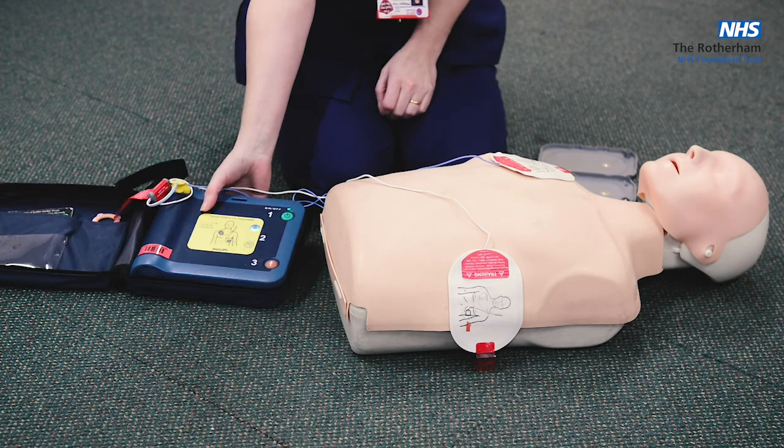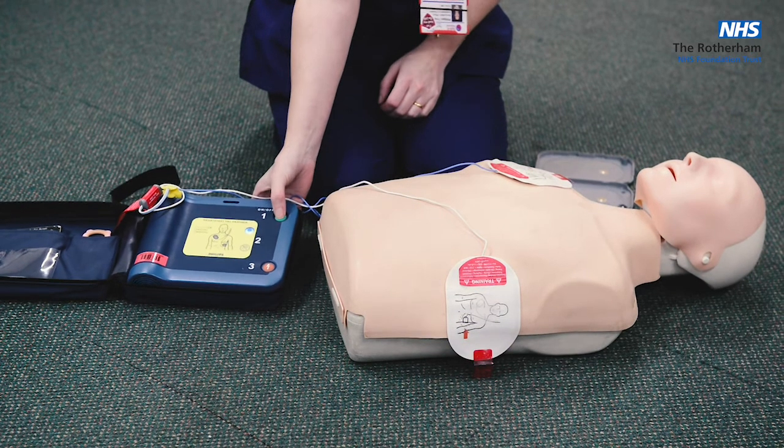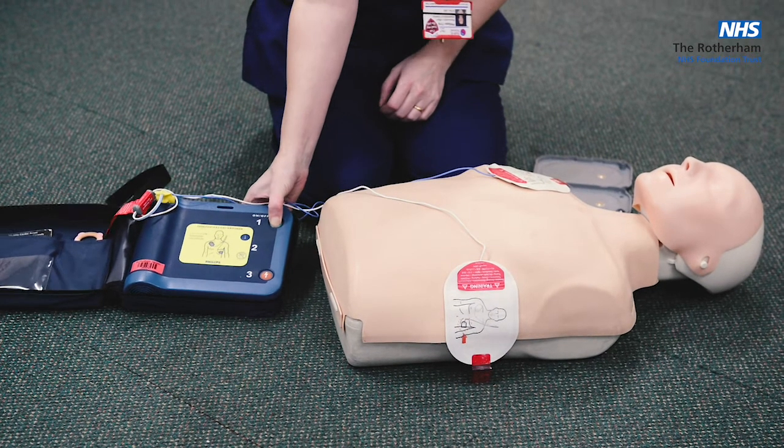The AED then instructs you to start CPR. For help with CPR, press the flashing blue button. At this point the instructor turns the device off, otherwise it keeps talking over the demonstration.